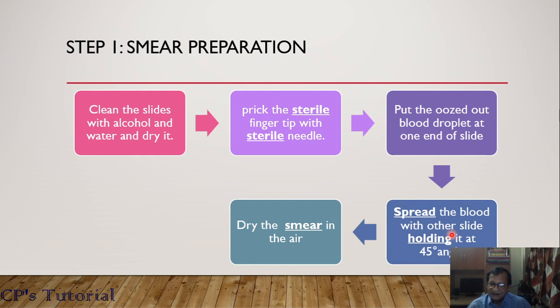Now the smear should be dried. The peculiarity of the smear is that its shape will be conical, tongue-shaped, and its color will be light reddish. The smear is dried in air for a few minutes, 1 minute or 30 seconds.